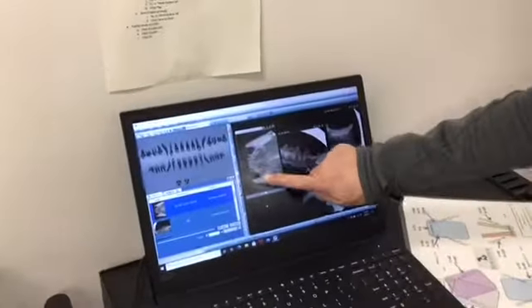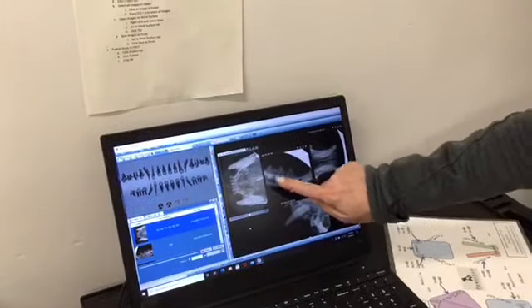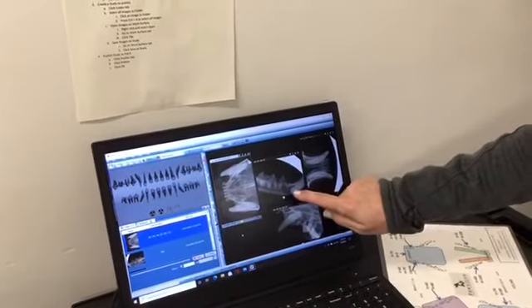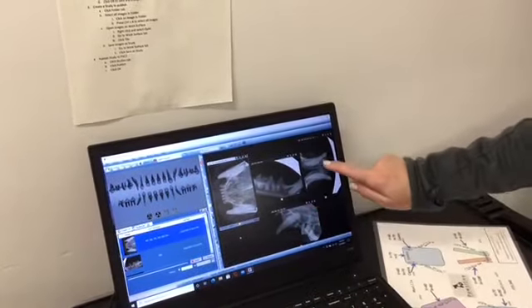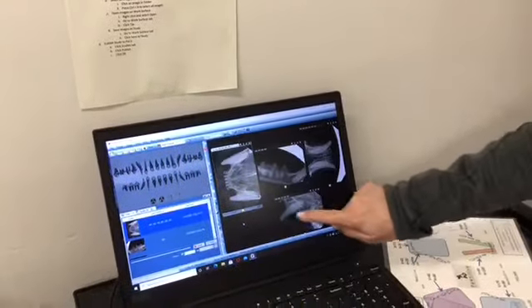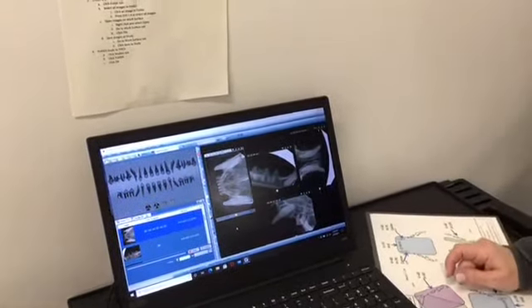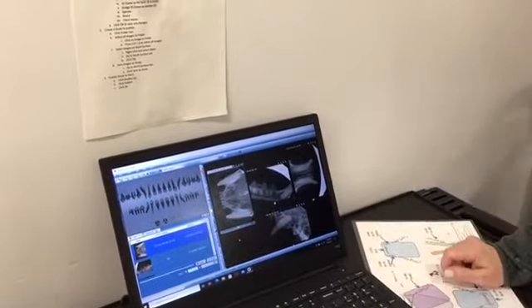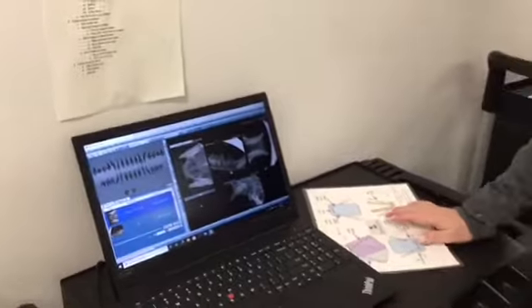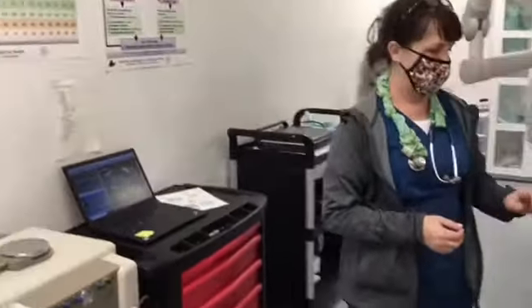And so this here is a picture of the upper teeth and the canines, some lower teeth, and you can see the roots here that sit underneath the gum line. You can't see that unless you take a radiograph. And then here's some bottom teeth, those little itty bitty bottom teeth and the big canines. And that right there is an upper canine. That is that big tooth that most of you probably see on your dog and cat if you were to look in their mouth. So we take radiographs to make sure that the teeth are healthy underneath as well as on the top where we can see.